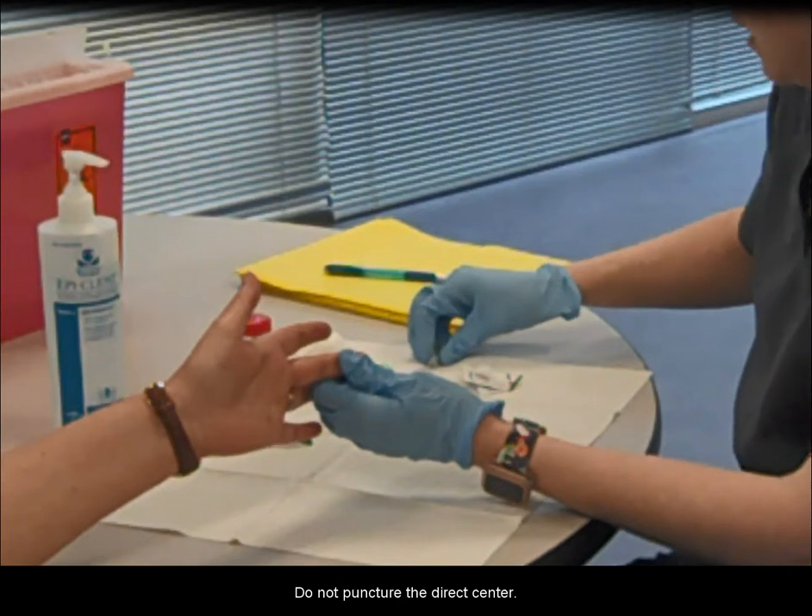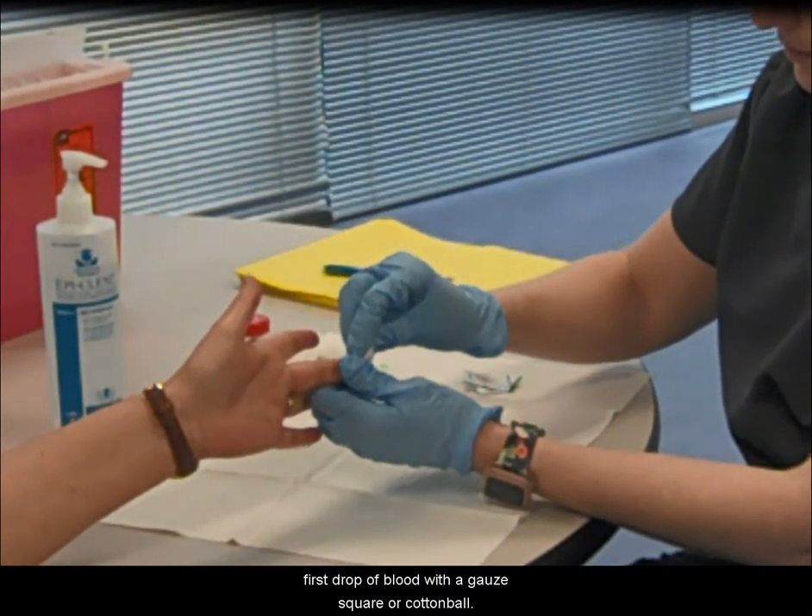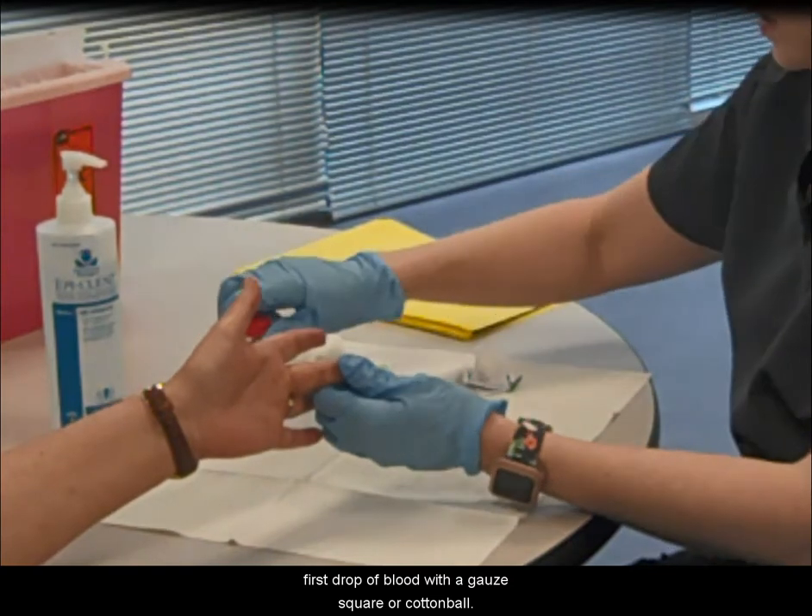Do not puncture the direct center. Discard the lancet in a sharps container and wipe away the first drop of blood with a gauze square or cotton ball.